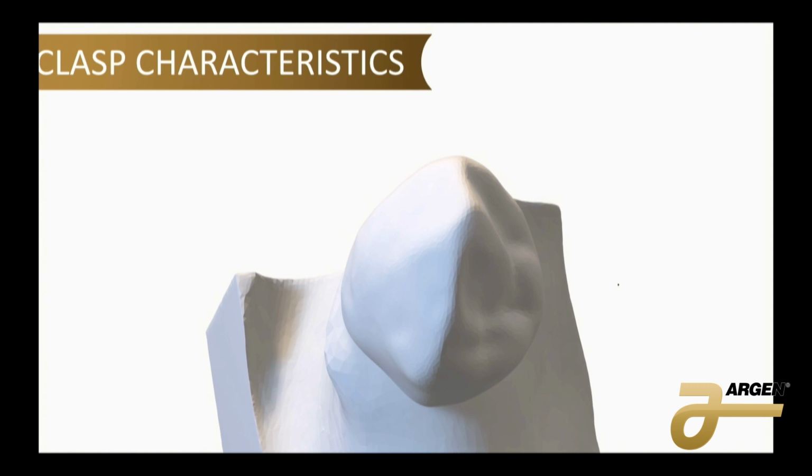It's the same thing when you're looking at an anterior tooth. We'll get into clasp design in a second, but if we're putting forces here and we're pushing on it, we still need something to reciprocate that force, something to hold it in. That can be a rest, that could be like an apron. If this is a premolar, that could be like another clasp. But on an anterior tooth here, typically what you would do is put a rest here, and it would not be engaging any undercuts. That would be fully blocked out. So the undercut is on this side, it's pushing, it's being reciprocated by something stronger over here.